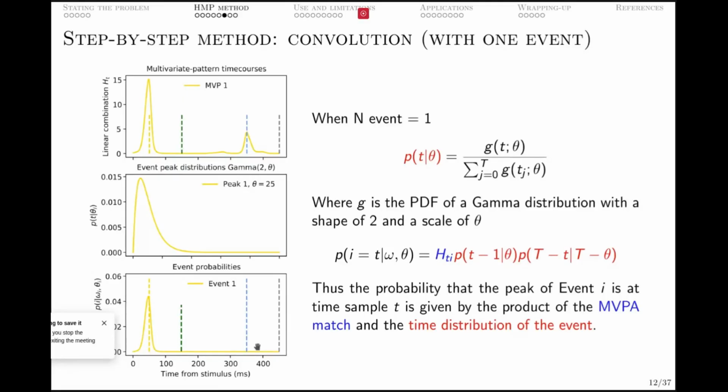So this can be seen as a way to increase signal-to-noise ratio also in EEG, but of course it also has its downside, right? Because we have the strong assumption that nothing is happening here. So just this is estimated, as we're going to see in a few slides. But in this case, this would happen this way, and in other data sets, it would happen another way.